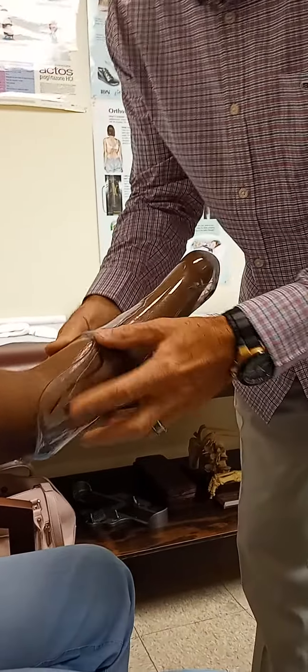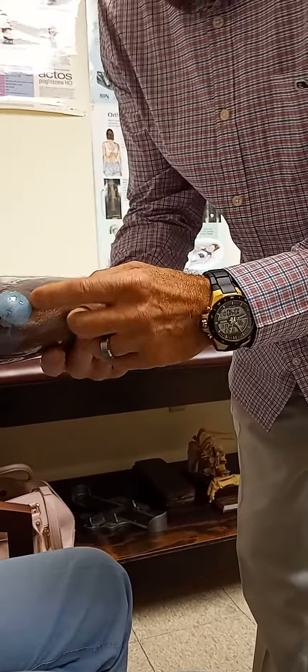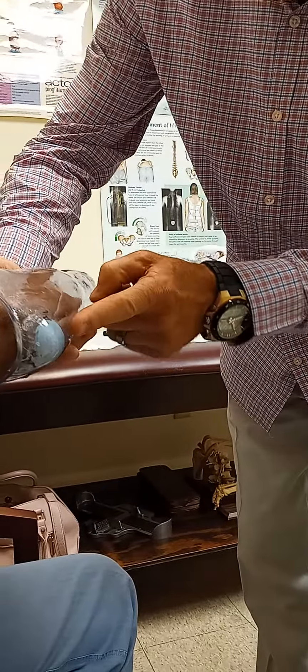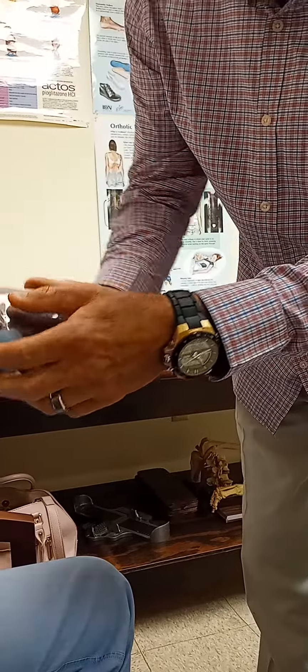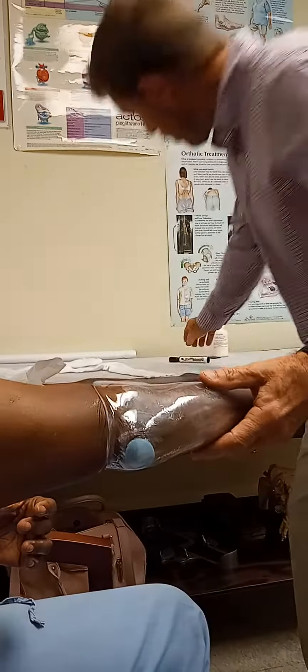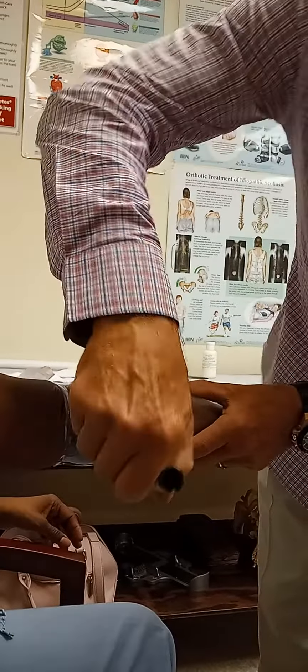It even went on easier. See how it's a little tighter in through here? See how we have more contact here? We're still loose back here — you can see right here when you go straight, bend a little bit there. You can still see where I've got to taper this in snugger here. And how that kind of holds on you like that. Just relax there a little bit. I need to mark — we need to taper all this area down here.